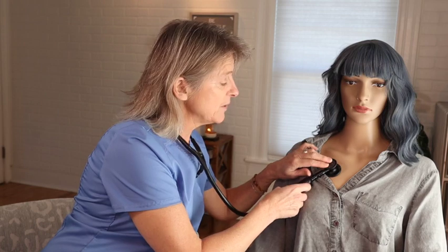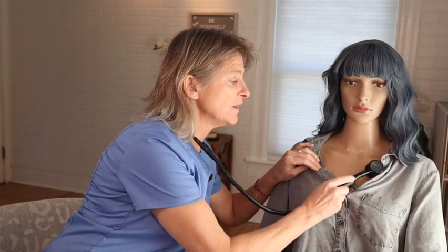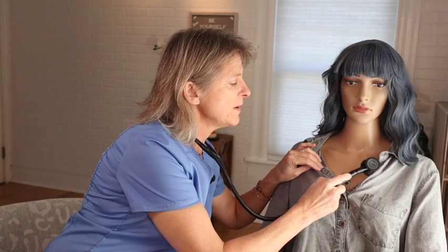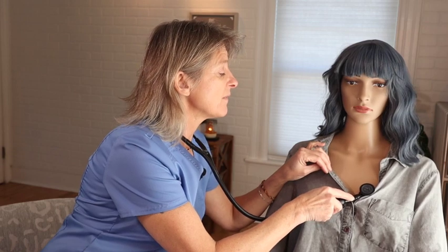On the right side, on the second intercostal space, I'm going to listen for the aortic area, and I'm listening for the S1 and S2. I'll go to the other side, right at the same level, second intercostal space, to the pulmonic area. And remembering that the diaphragm picks up on higher frequencies, so I'm going to go a little bit lower and get to the tricuspid area. So we're going to go around the fifth intercostal space, right along the sternal border there, and I'm going to listen there. And from here, I'm going to go ahead and flip over to the bell.